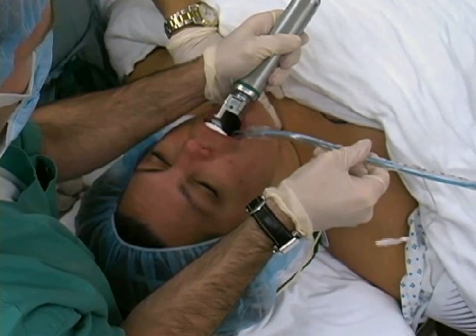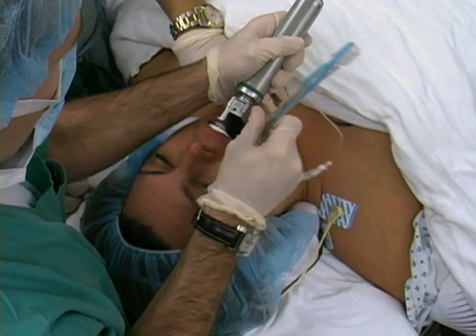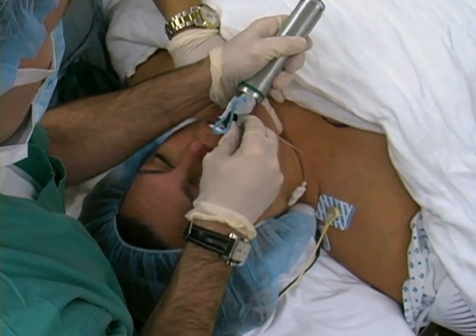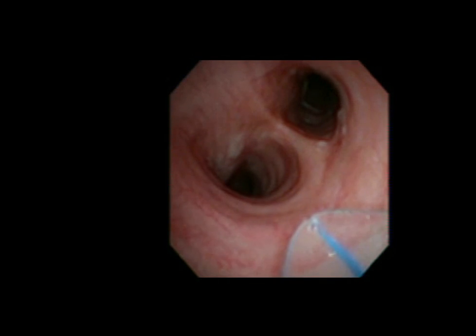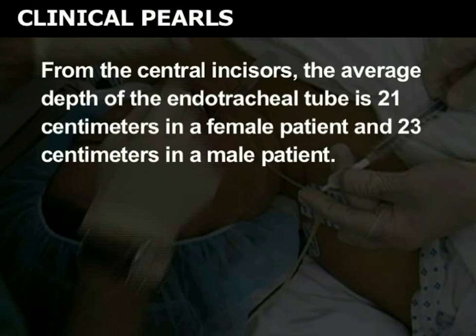Place the endotracheal tube in the right side of the mouth, advancing it toward the glottic opening. The tube should not obscure your view of the glottic opening, and you should watch the tube pass through the vocal cords. If a stylet is used, it should be removed immediately after the endotracheal tube passes through the cords. Continue to insert the tube to a depth 2 centimeters above the carina. From an endoscopic viewpoint, you can appreciate the appropriate depth of the endotracheal tube in relation to the carina. From the central incisors, the average depth of the endotracheal tube is 21 centimeters in a female patient and 23 centimeters in a male patient.